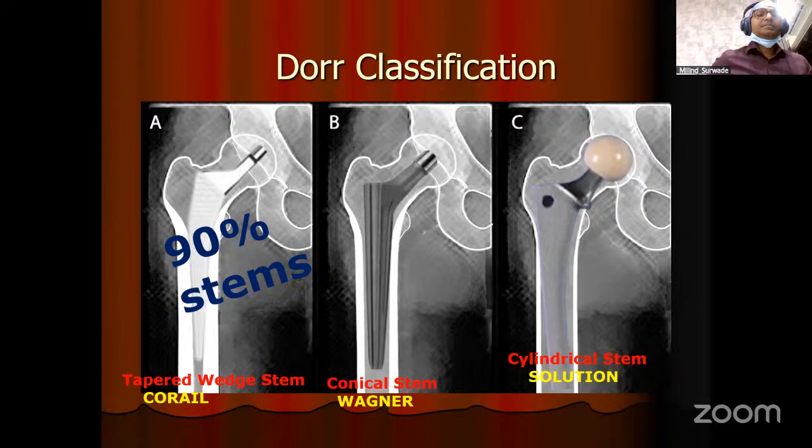First, if you use the Gription cup and that patient comes for revision, when you remove that Gription cup, it will take away a lot of bone along with it. So you will be dealing with a very big void in the acetabulum in your revision scenario. Removing a plain Pinnacle cup without the Gription coating is easier and simpler. So that is the reason we should use Pinnacle cup in most situations. The added coating is to be reserved when you are not sure, when you are not getting full 60 to 70% coverage. The advantage of Gription is that even if you get 50%, 60% coverage, it's going to stick well.